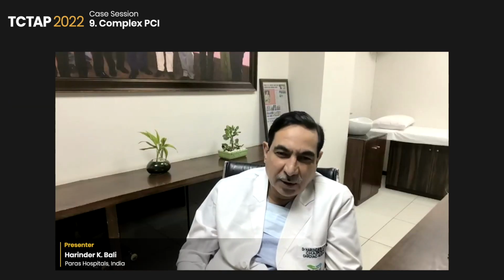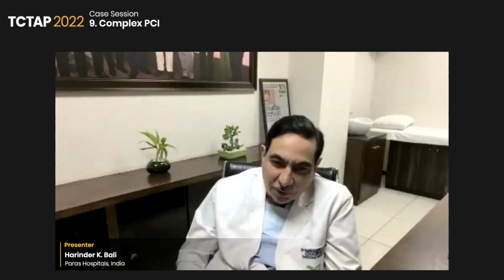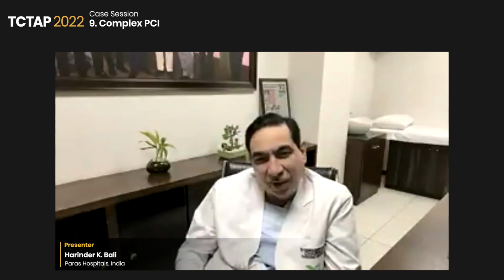Yeah. I think this ramus was a significant vessel. This was at least a 2.5 millimeter vessel. So I thought that that needs to be preserved. And the idea was to do a provisional. And we did only balloon of the ramus. Finally, we did a kissing. We did not put in 3 stents. So I thought we should take all efforts to preserve that ramus vessel as well.